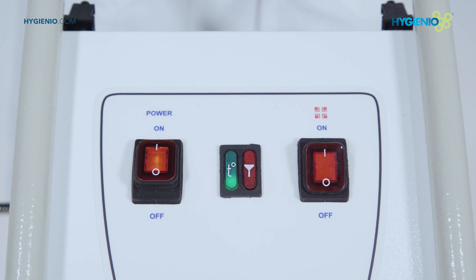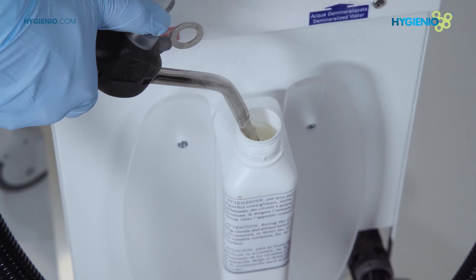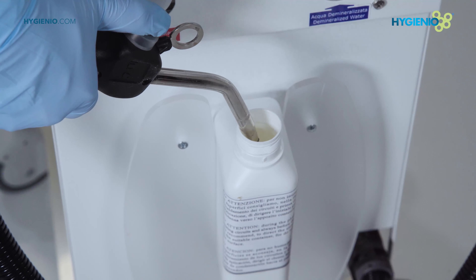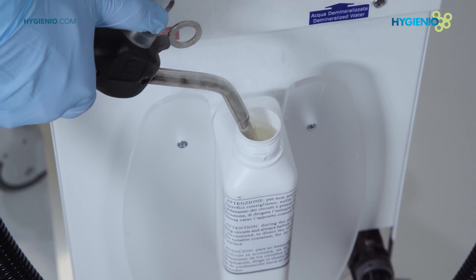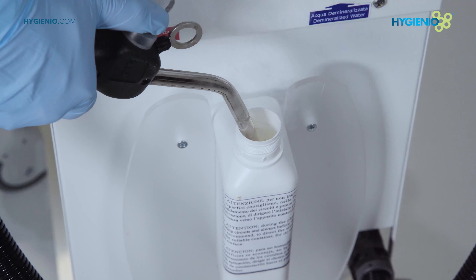Wait for the pressure light, green color, to come on and proceed by dispensing the jet into the condensation collection container for about 30 to 40 seconds. At first, just water will come out. Then, when the circuits are heated, steam will come out.